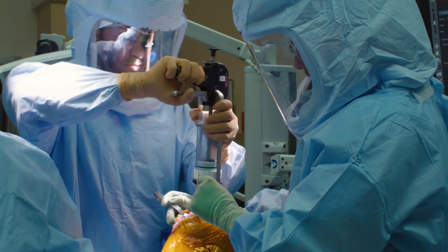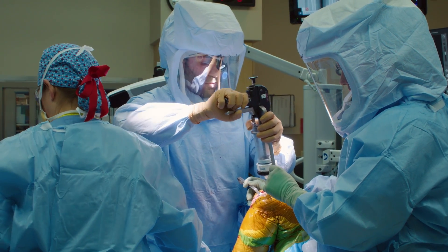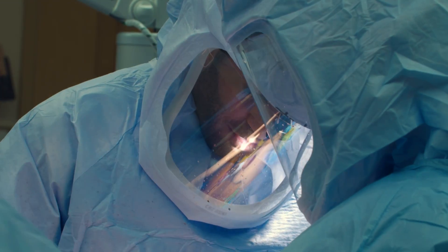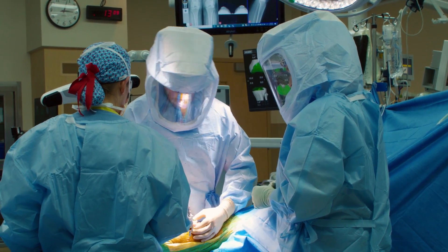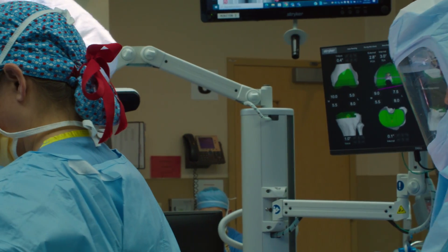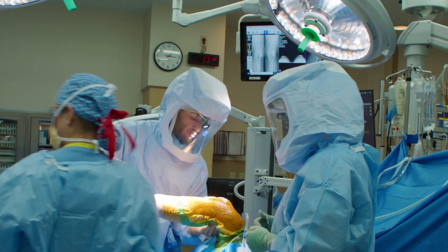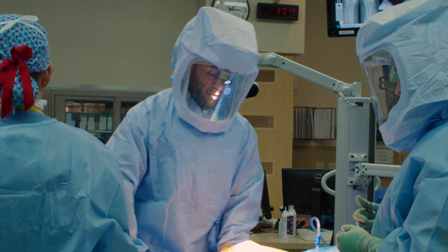Now we're going to cement the femur and then try our plastic insert trial one more time just to make sure we like the gap. We put the patella on and clamp it into place. Now the implants have been cemented in place. Taking the knee into full extension — the knee is nice and straight, great alignment. The knee is nice and stable in flexion as well, goes all the way to full extension with great range of motion. Now we're going to close up.